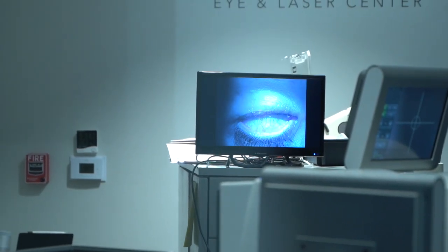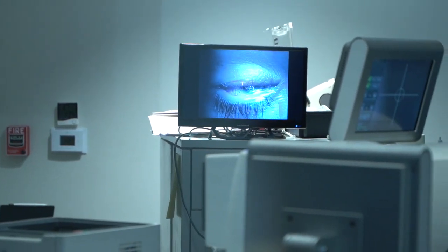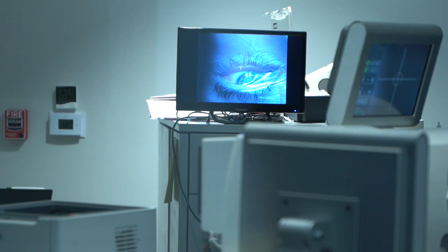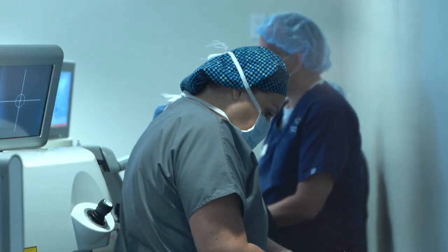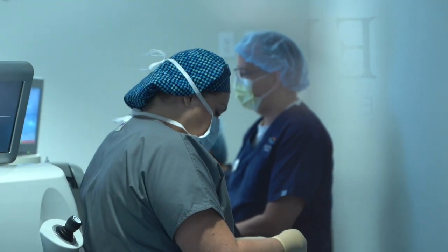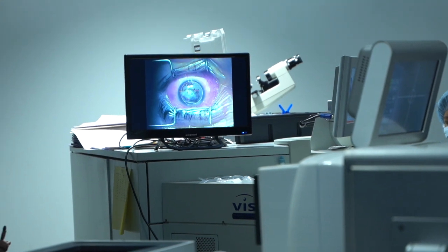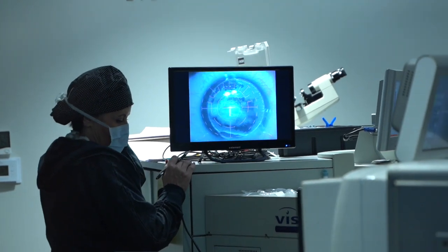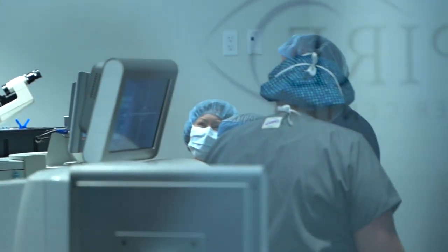Okay, this was opening my left eye, getting started. Just had to move my lashes out of the way and open up my eyelids. This was a bit uncomfortable, but you get through it. No biggie. Alrighty, eyes are open. Ready to get the laser in there. A bit uncomfortable, but at least it's quick. Another 15 seconds here, and voila, the laser does its magic, and I could see.